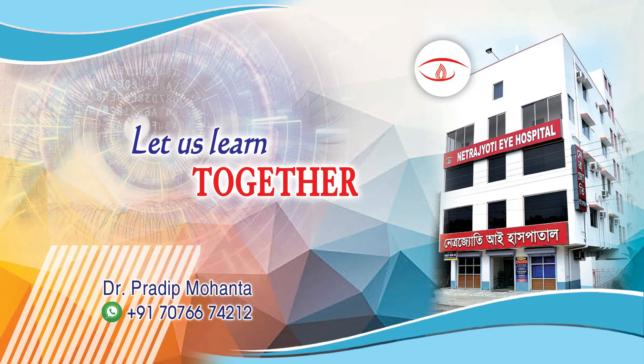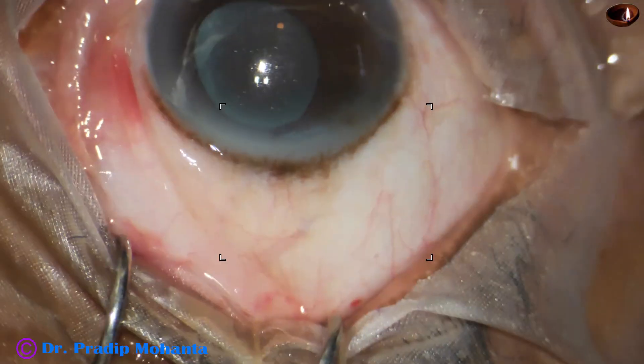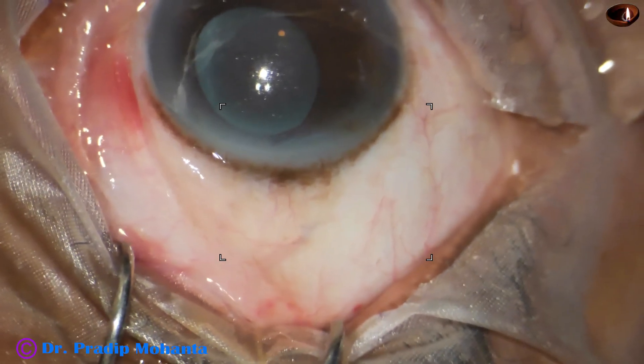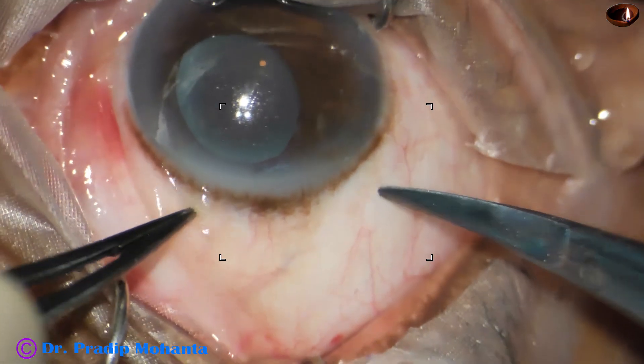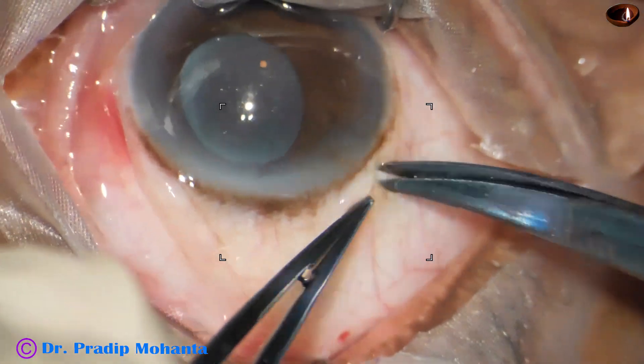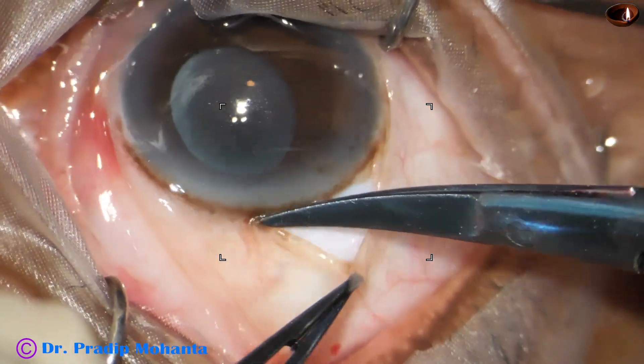Friends, welcome to my workplace at Ranaghat, West Bengal, India, for hands-on FECO and SICS training. This is an opaque intraocular lens. The pupil is small, the lens haptics are not seen — haptics are covered by the iris — and I have to explant this lens and place a clear lens.